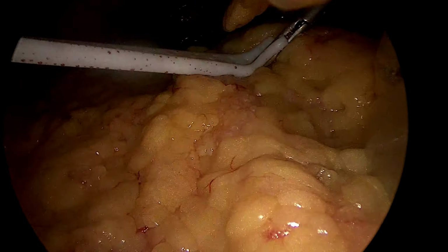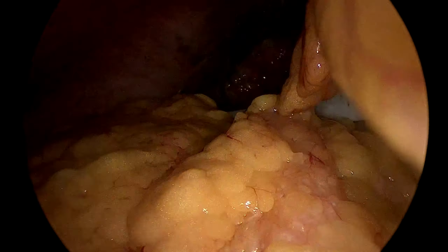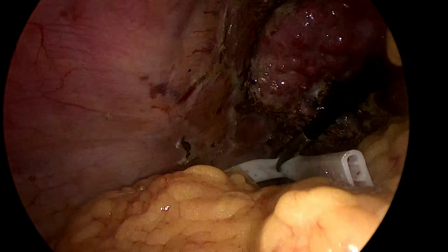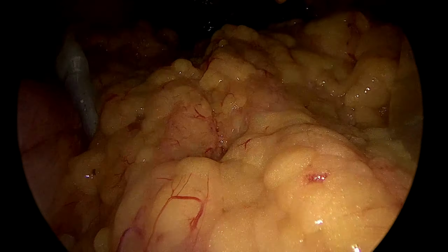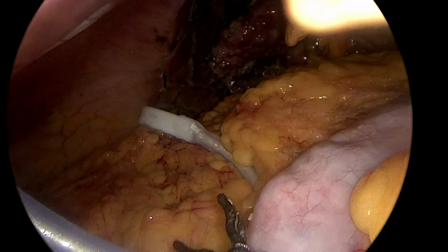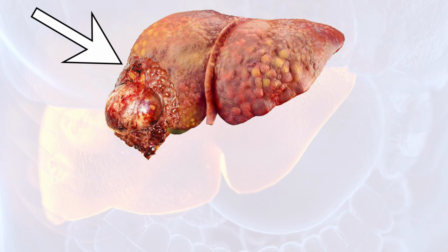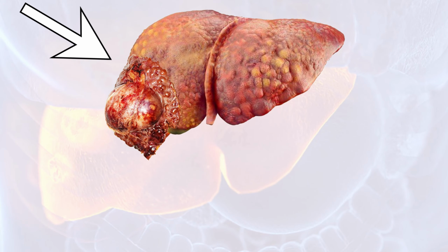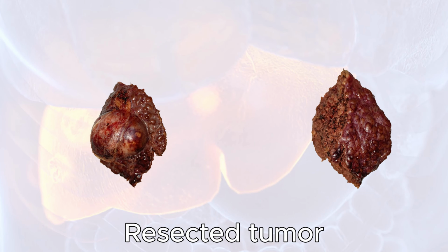Finally, a single closed suction drain is placed in the subhepatic space to monitor for any post-operative fluid collection. This concludes the laparoscopic liver resection for hepatocellular carcinoma. The abdomen is desufflated and all ports are removed under direct vision. The patient tolerated the procedure well. This is the tumor we removed. These are original pictures of the specimen, showing the superior surface and resection margin.